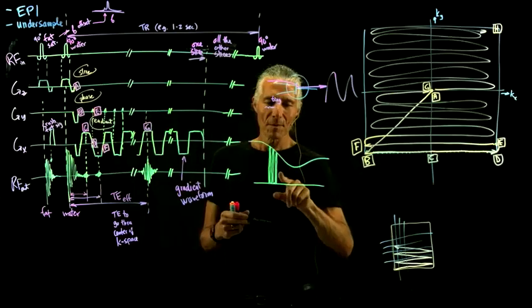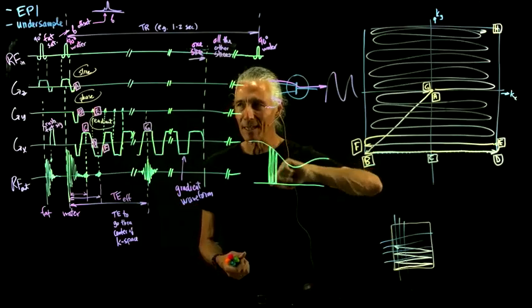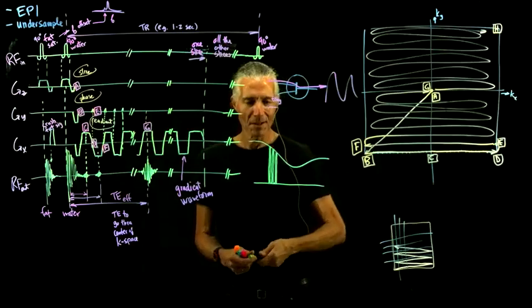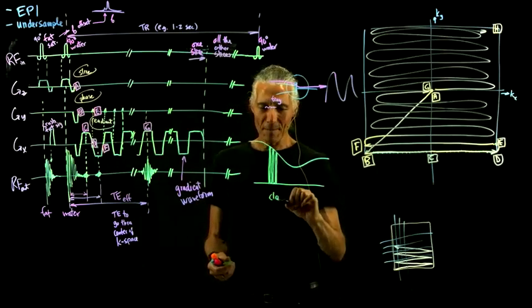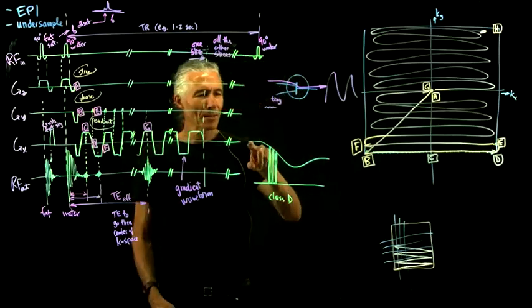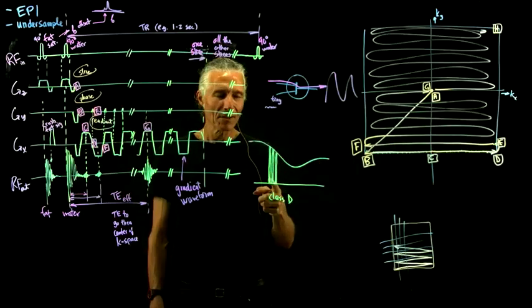What's actually happening deep in the bowels is these things are just switching like 100,000 times a second, turning on and off. That's called a Class D amplifier. So it's sort of simulating an analog signal with these little digital switchings.